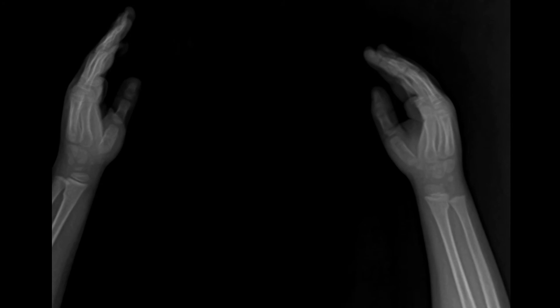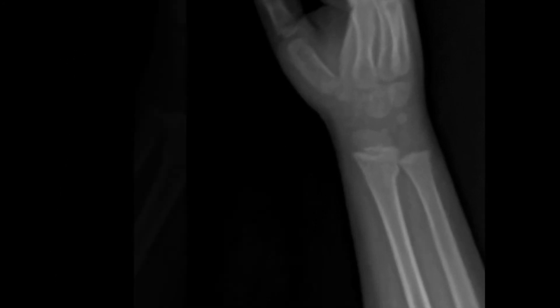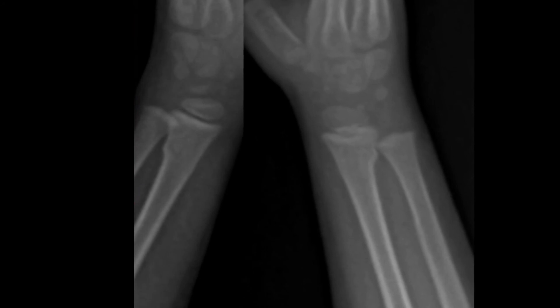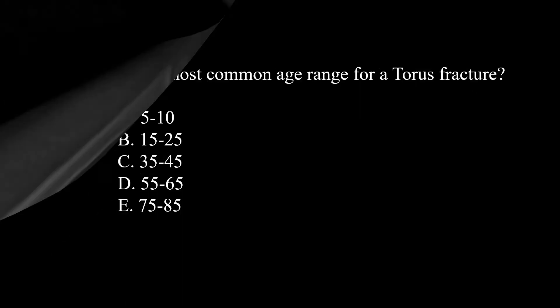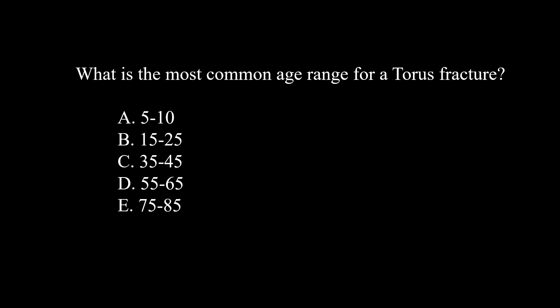This poor kid fell from a tree, and an inexperienced X-ray tech attempted a bilateral view. If we zoom in, you'll notice bilateral torus buckling fractures of the radial metaphysis.